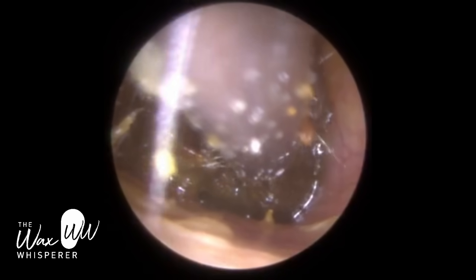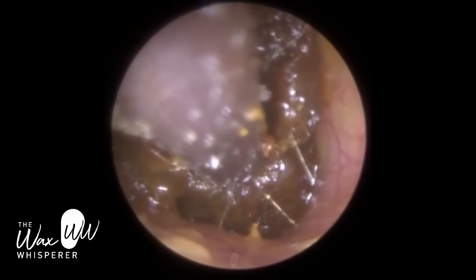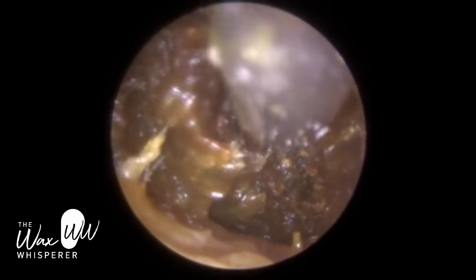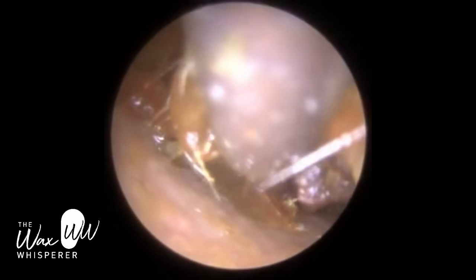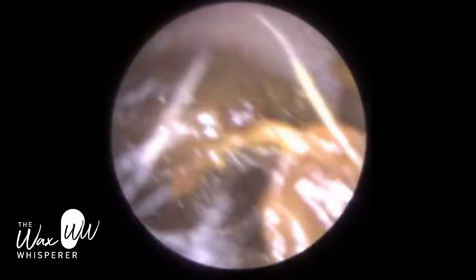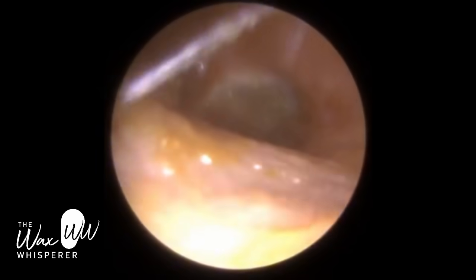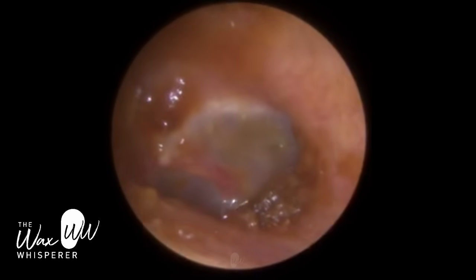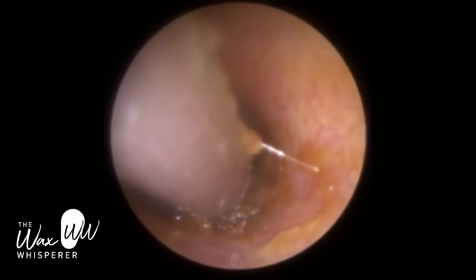On the left side, just using the Zolnir Suction Pro. This is the only instrument we can use for this particular patient, with the wax being so deep, medially impacted. You can't use the ear hook - it will just slice through this soft wax. Similarly, forceps and a Jobson horn - it's just too deep in. If you're trying to get a Jobson horn in behind this wax, you're going to graze against the ear canal wall and make contact with the eardrum. So we used endoscopic ear suction - what I have coined and termed e-suction.